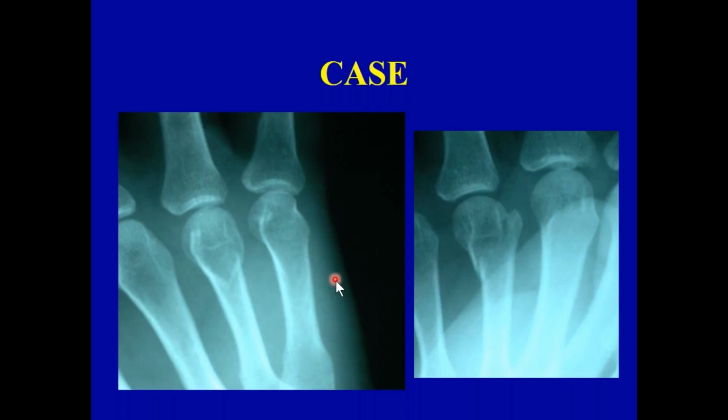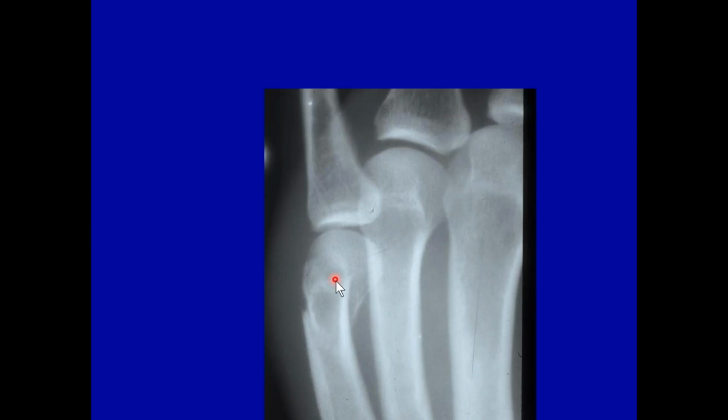So that's where you would come into the picture. Did you produce a good hand x-ray? Here is a hand x-ray, in this case of the fifth digit, and this is just a nice example of what happens if your fist hits somebody else's nose or the wall. It's something called a boxer's fracture, but boxers know how to clench their fists and they have tape put on. They know how to protect themselves. Most people, when they're angry and don't think rationally, are not going to go through that.